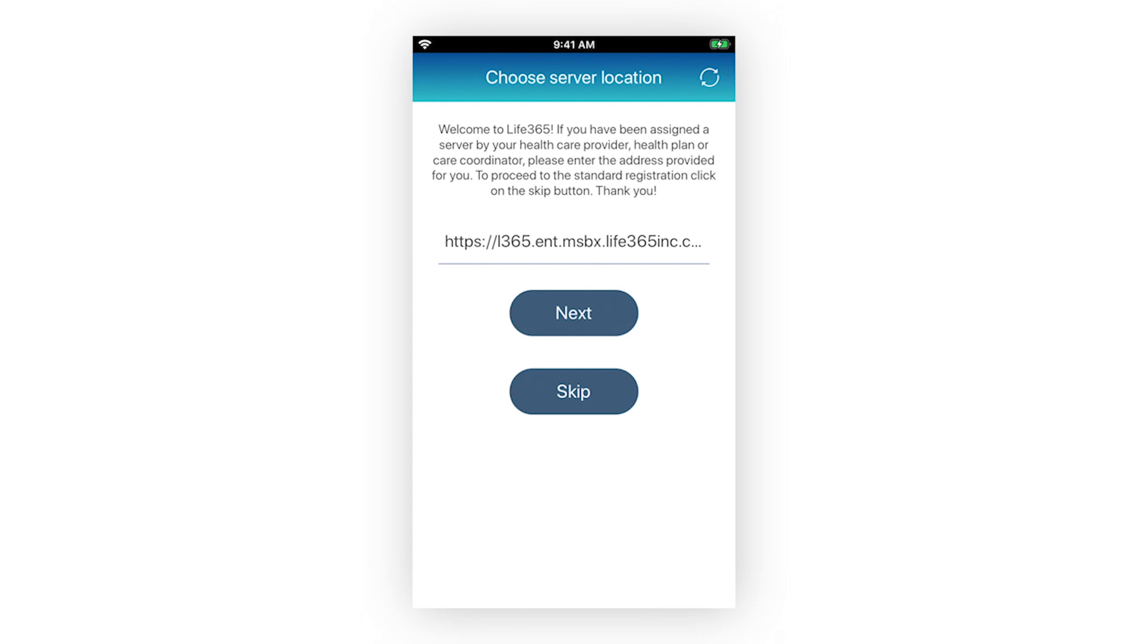Now let's cover the account basics to get you started. If you are associated with a healthcare organization, enter your assigned server address provided to you by your healthcare professional. Once entered, select Next.